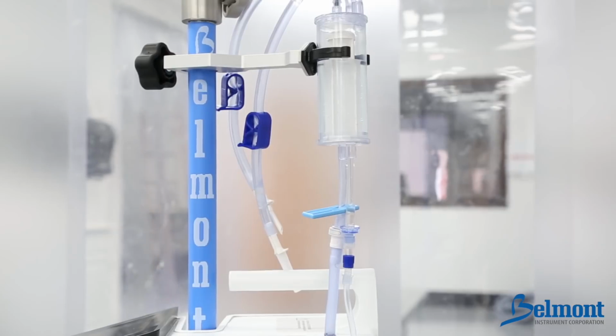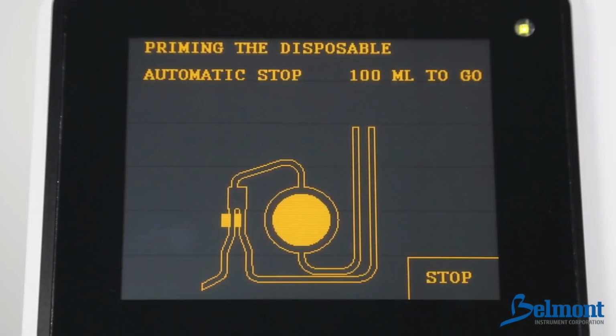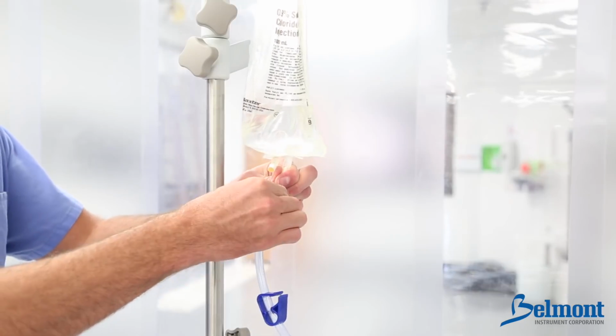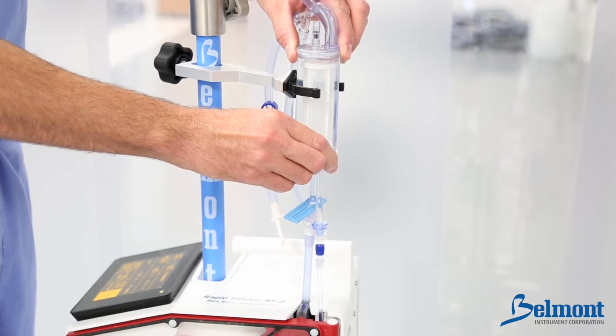The roller pump will automatically prime the system in about 13 seconds. Fluid will be drawn through the tubing while the air will be directed out through the recirculation and vent line. During prime, the 100 milliliters to go will count down to 0. If the Belmont Rapid Infuser RI-2 does not count down or resets back to 100 mLs, confirm that there is enough fluid in the system and that the tubing is not kinked or stretched too tight.